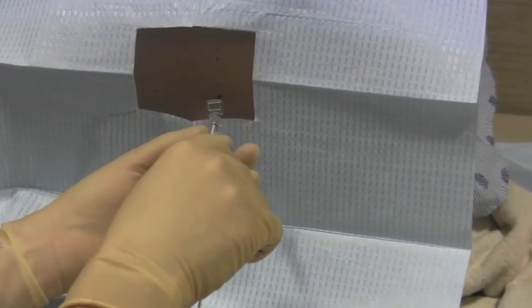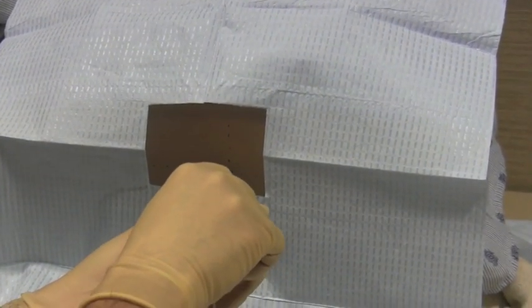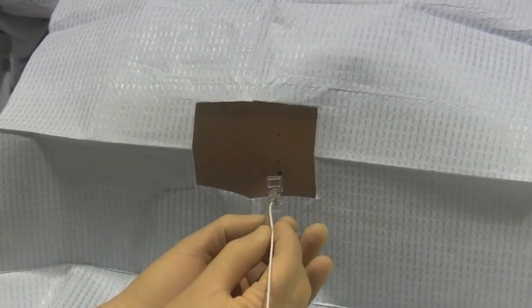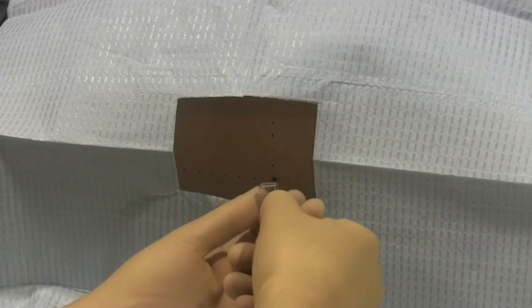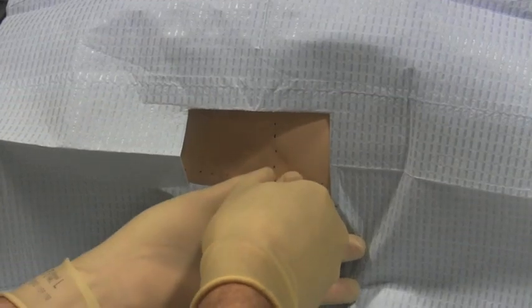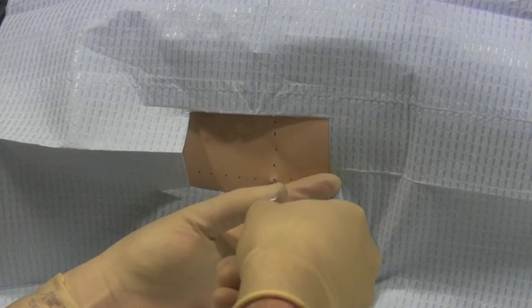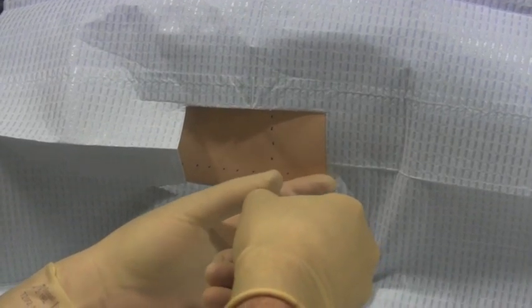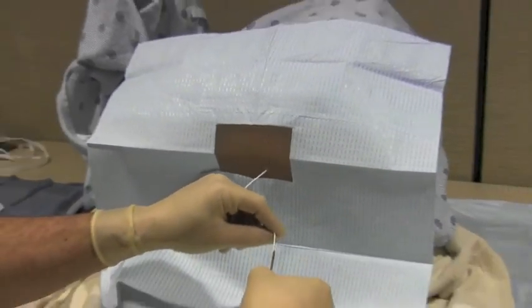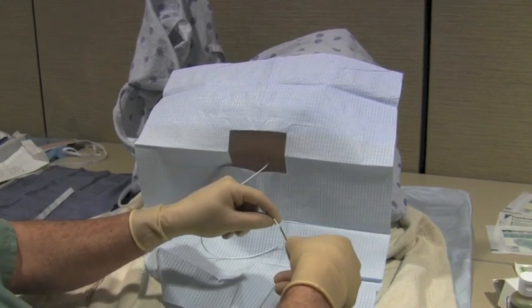At no point do we want to pull back once we start inserting, or we risk shearing the tubing off against the sharp needle tip. Once the catheter is in, we will gently advance and we will pull the needle back while holding the catheter in place. The needle will be pulled out over the catheter. At no point is the needle re-advanced or is the catheter pulled out against the needle, as this can lead to shearing of the catheter.